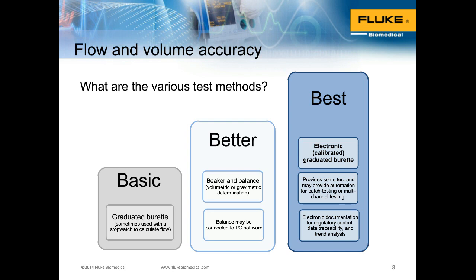Many manufacturers recommend this as well. Now, I've been asked this question many times. If a beaker and balance is recommended, can other methods be used? They can absolutely be used, because when a manufacturer recommends a method, that is something they may have used with gravimetric scales, which are very, very highly accurate test systems to ensure the flow accuracy of their devices.